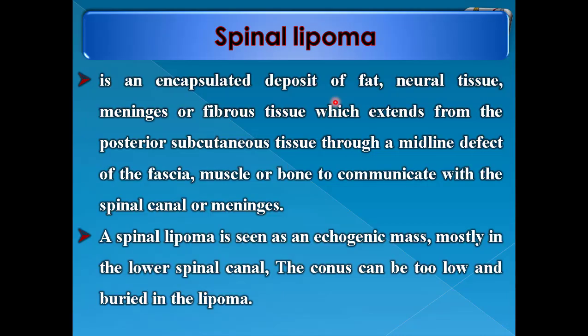Spinal lipoma is an encapsulated deposit of fat, neural tissue, meninges, or fibrous tissue which extends from the posterior subcutaneous tissue through a midline defect of the fascia, muscles, or bone to communicate with the spinal canal or meninges. A spinal lipoma is seen as an echogenic mass, mostly in the lower spinal canal. The conus can be too low and buried in the lipoma.